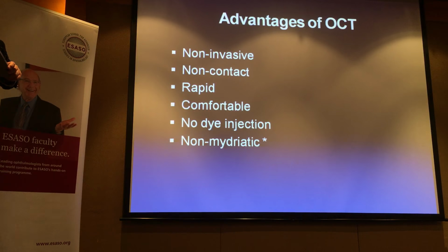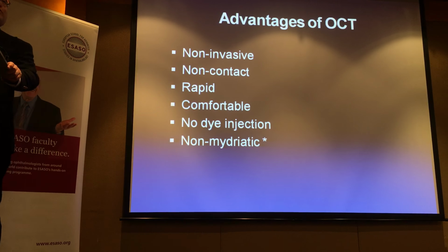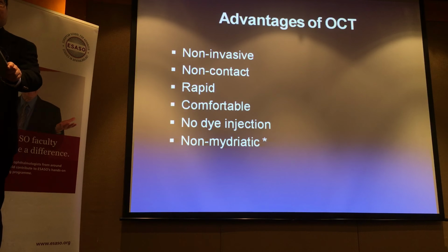So, we all know OCT, but just a quick recap. How is this an advantage? It is non-invasive. There's no intravenous access required. There's no dye injection required. It's non-contact. You don't touch the patient. It is obviously rapid. It's comfortable for the patient. It's typically non-mydriatic, meaning you can do an OCT on an undilated pupil.